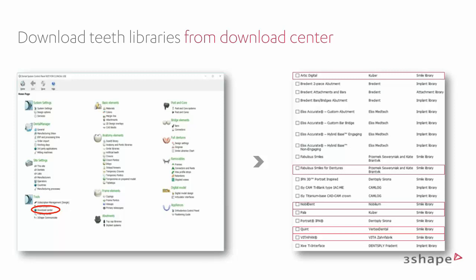There's an improvement in the crown and bridge workflow where you can do this, but for the dentures, it's still not possible. We are, of course, going to work on this and implement that. But we don't have a timeline in terms of when this will be enabled.